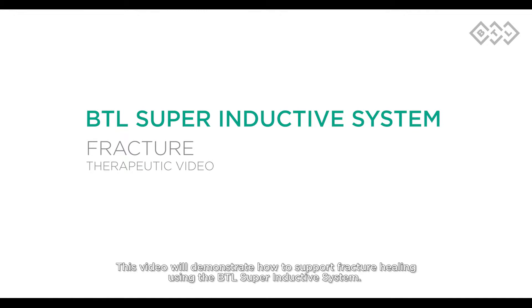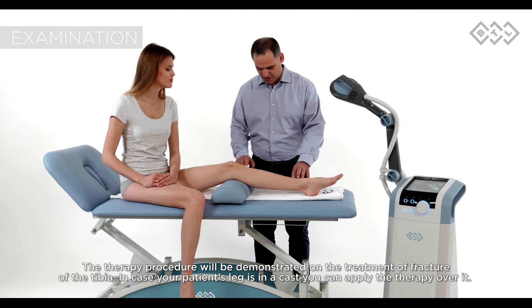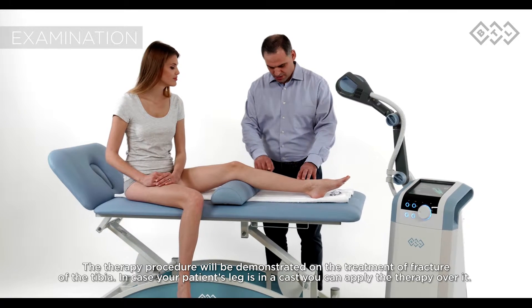This video will demonstrate how to support fracture healing using the BTL super inductive system. The therapy procedure will be demonstrated on the treatment of fracture of the tibia.